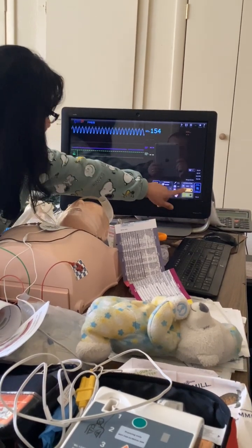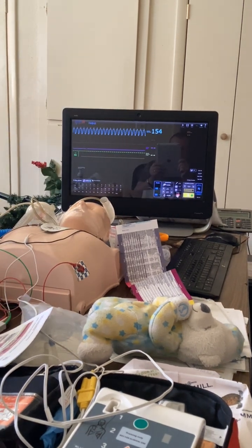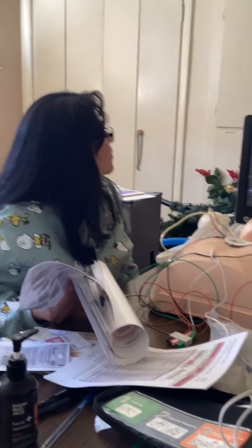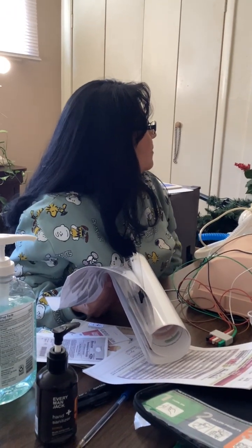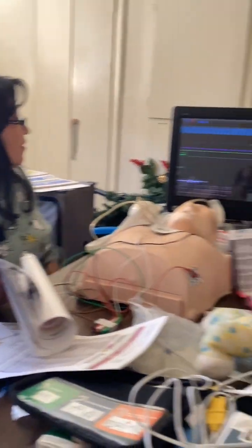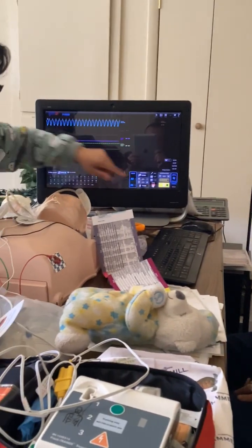Sorry. That's okay. Charge. Is it in sync? It's in sync. How do you know? It's in the R interval. Perfect. R markers. You're doing beautifully. So go ahead and deliver the shock. I'm going to take the O2 off. Okay. Clear. We're all clear.